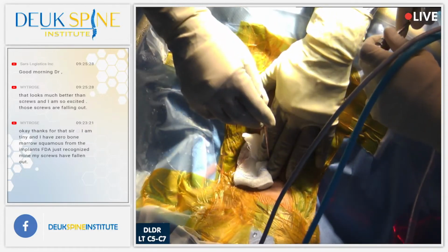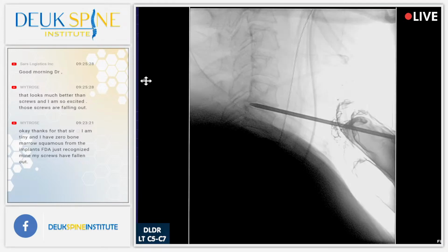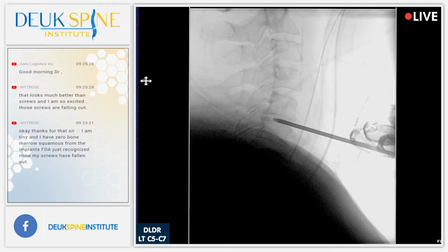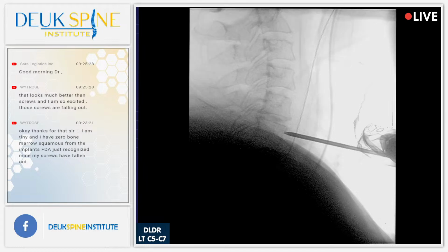You all see that shot? Now I'm going to move this dilator out of the disc and move it to the next one down. All right, let's get started. We need a little shoulder action, a little inline traction, head straight. I need my team helping me, and I'm going to move this thing out of the disc and to the next one. Shot, I'm out. I could feel it. I want to stay in the midline. Let's get an AP shot.